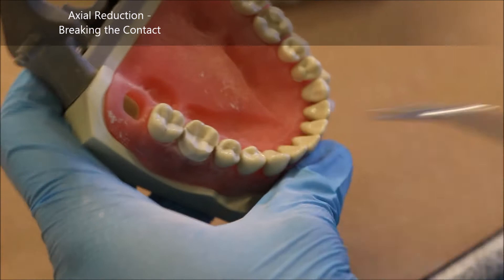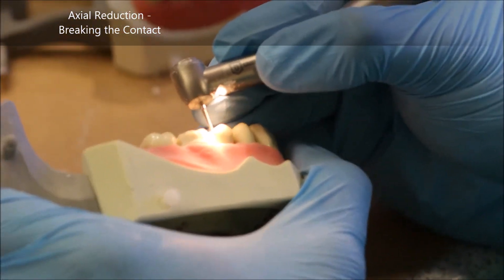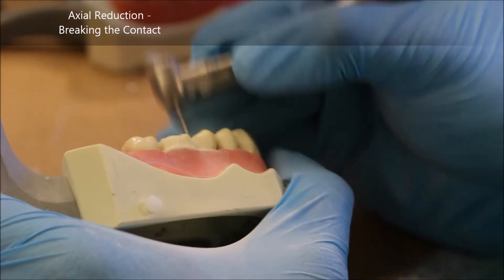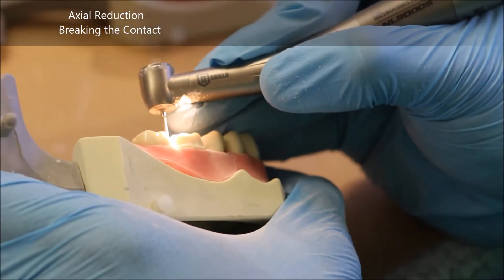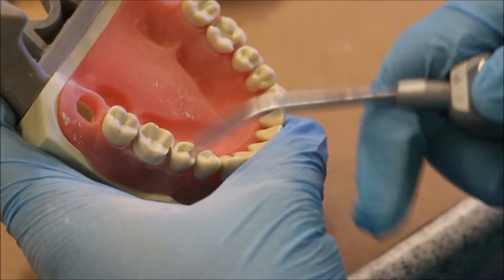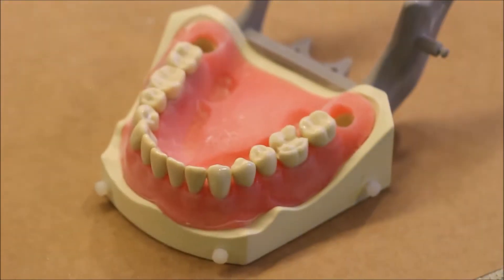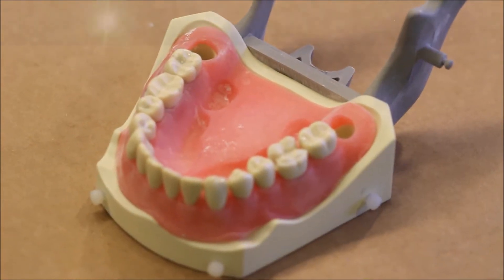Another quick check — I've made it about halfway through the interproximal contact, so I'll continue on. For those struggling with the 850 and getting the interproximal break, the 8850 is a much finer grit diamond burr that is also somewhat thinner at the tip. It's worth trying if you keep nicking your adjacent tooth. You can also get other burrs on the market with much smaller diameters, such as an 850-010 or a 1mm 850 instead of the 1.2mm we have.